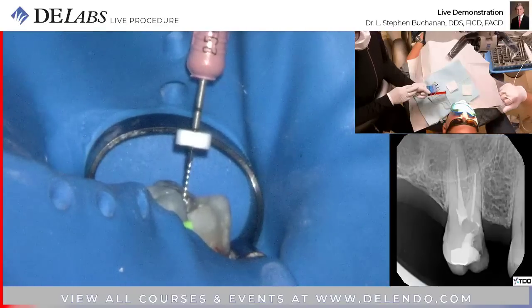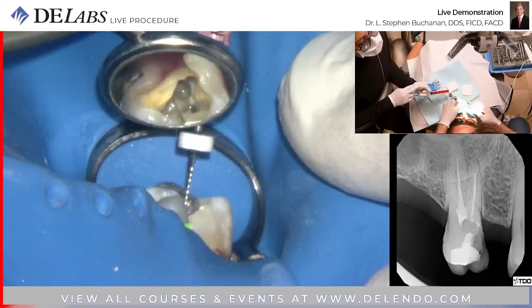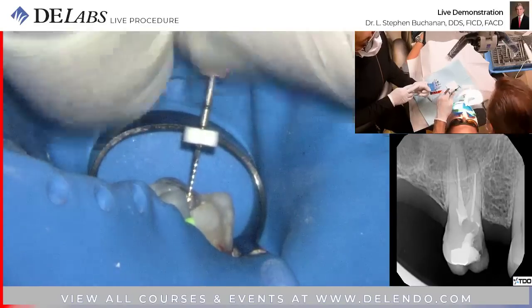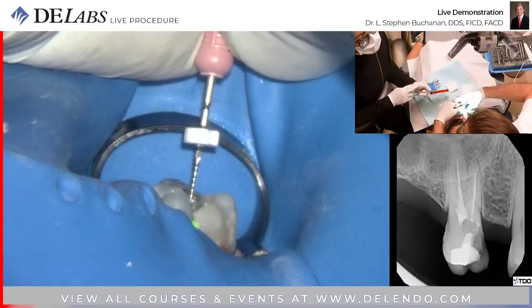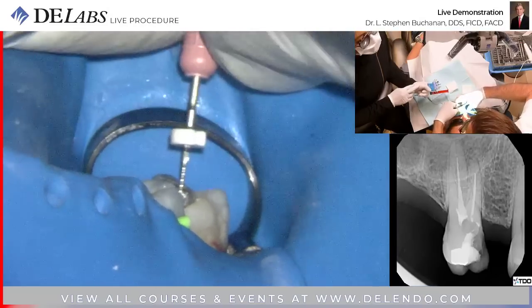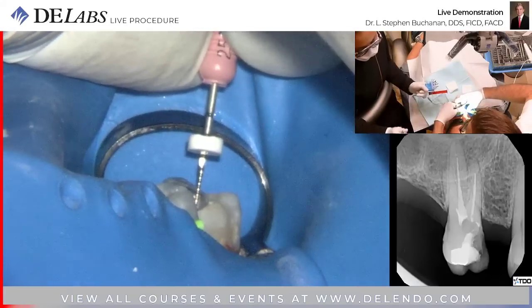Oh, yes. Unless it's in the adjacent canal. It is not. There's an MB3. Okay, I'm proud. Does that really excite you, finding MB3 and MB4? MB4 just is, that's too much work. Yeah. After the MB3, it's, you know.